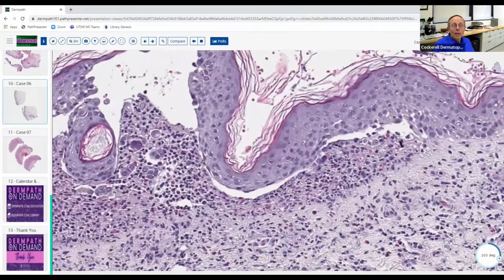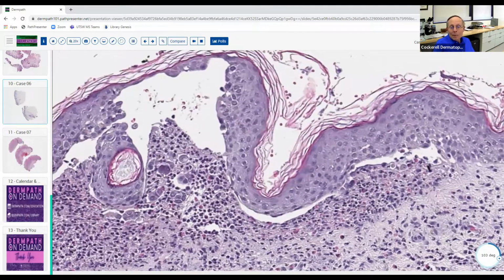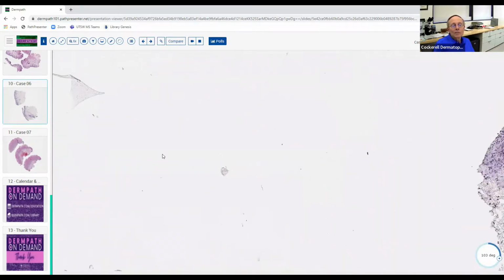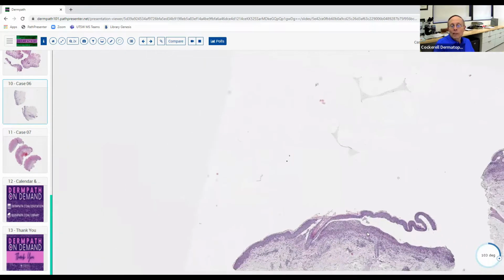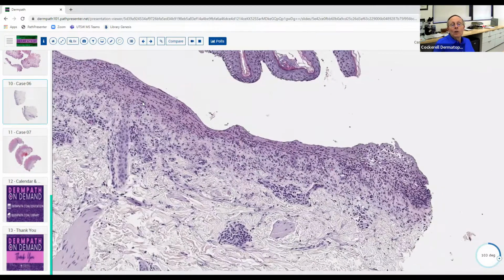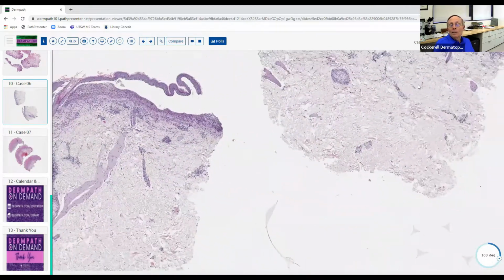And the other thing is, you'll notice you got a couple of acantholytic cells. Anytime you get lots of neutrophils, lots of polys, you can get secondary acantholysis. So this isn't really an acantholytic process. It's kind of secondary. Probably the real classic pathology is the other one over here, where you've got the subepidermal blister with the neutrophils primarily. So this is dermatitis herpetiformis.